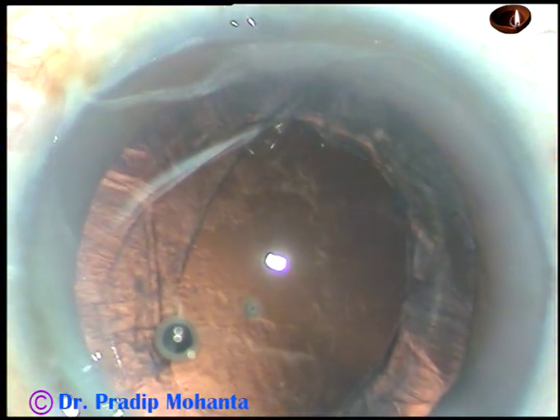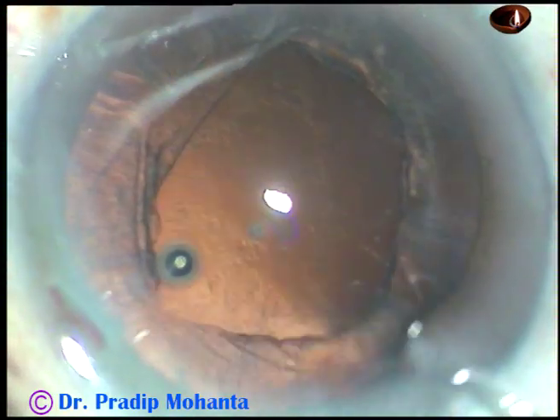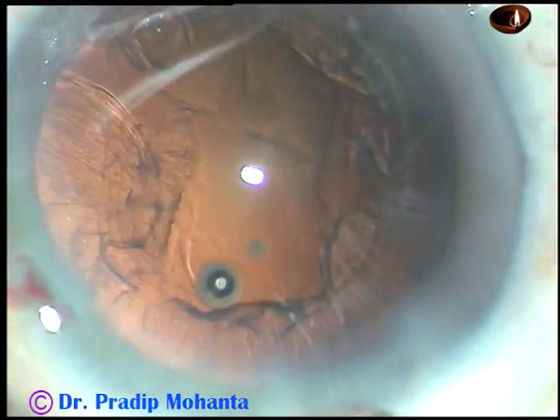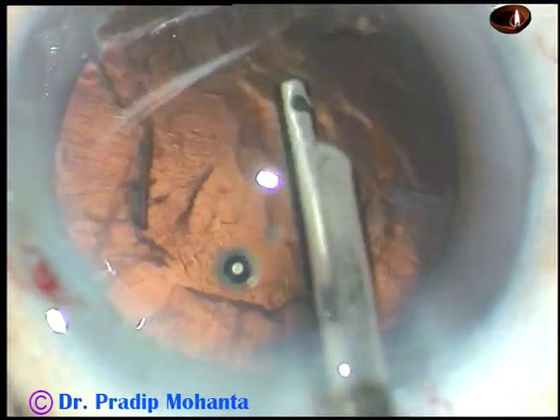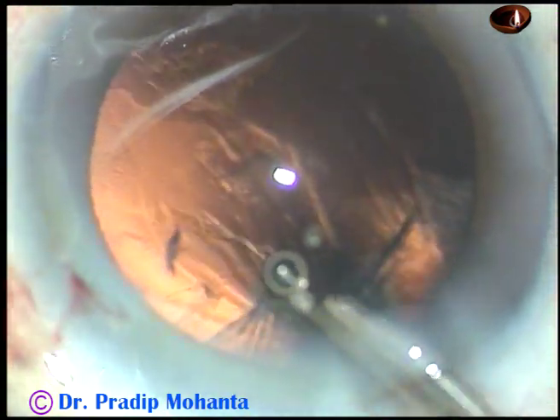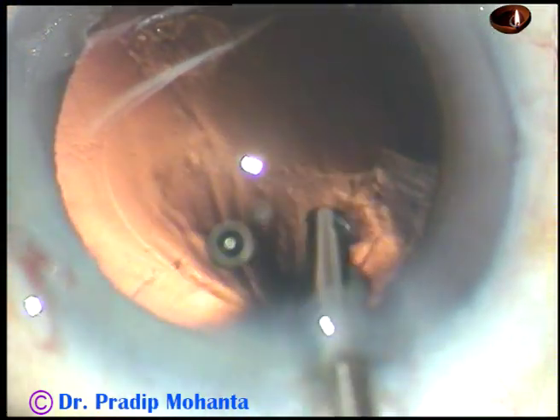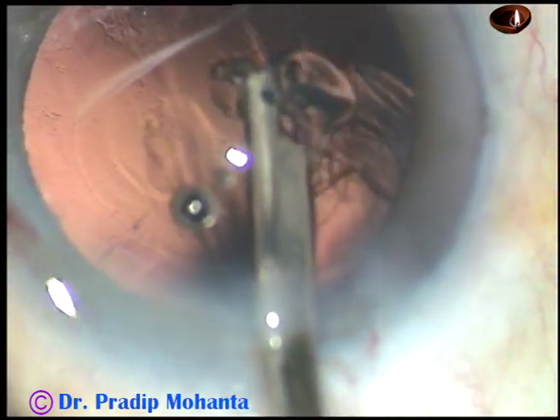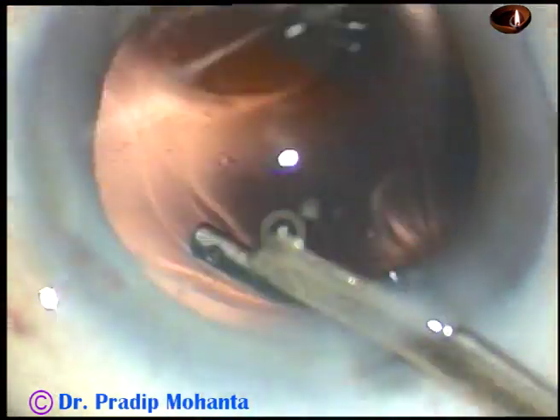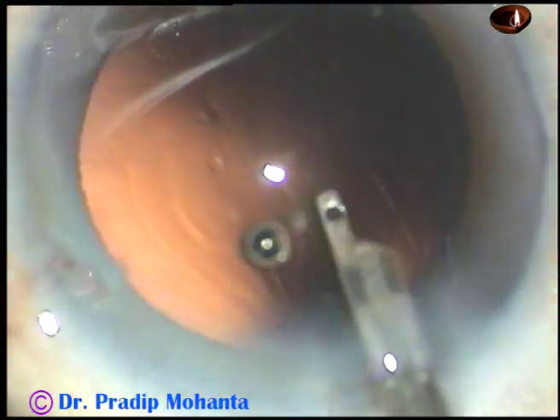And now visco is injected, and in this case a 23-gauge Simcoe cannula is being used to remove the cortical lens matter. The Simcoe cannula is attached to a 10 cc glass syringe. The lens matter has been removed. I didn't have to go through the side port — in many cases we can manage going through the main incision.